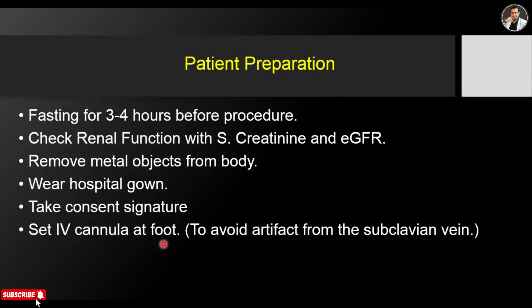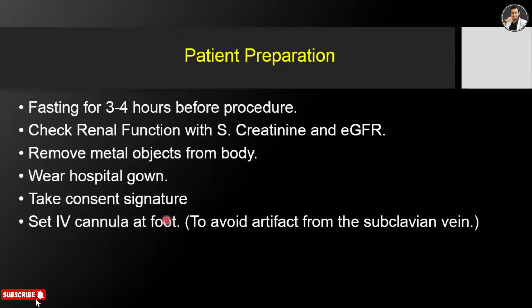We have done a cannula in the patient's hand in all angiograms. But in this angiogram, which is the upper limb angiogram, we will cannulate with the foot and give contrast with the foot. The true artifact is the subclavian vein. If we put contrast in the hand, then it will be an artifact on the angiogram. We have to cannulate with the foot.